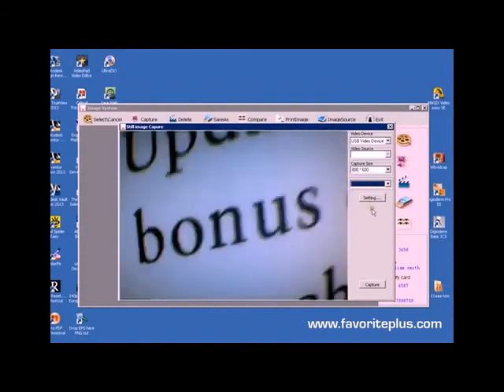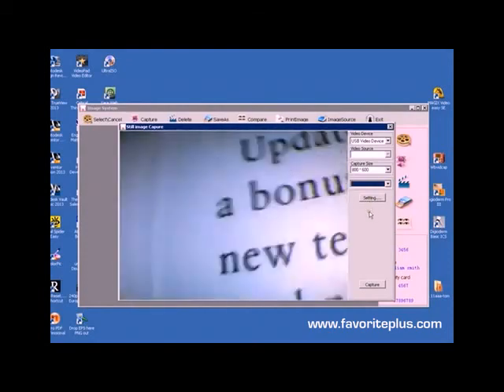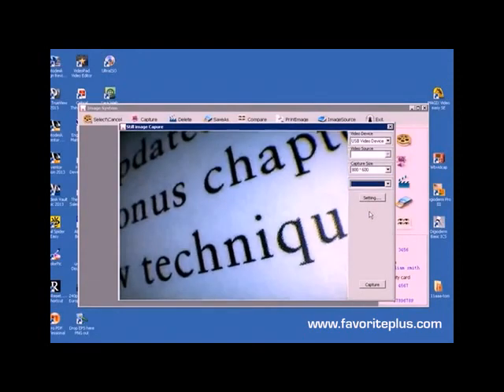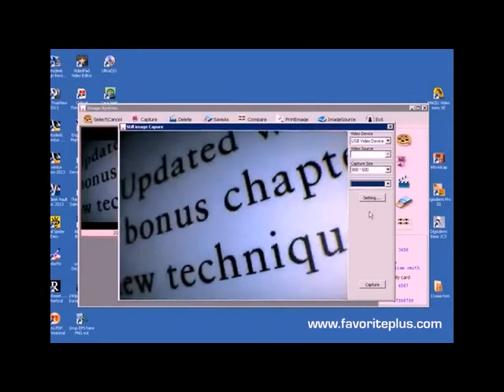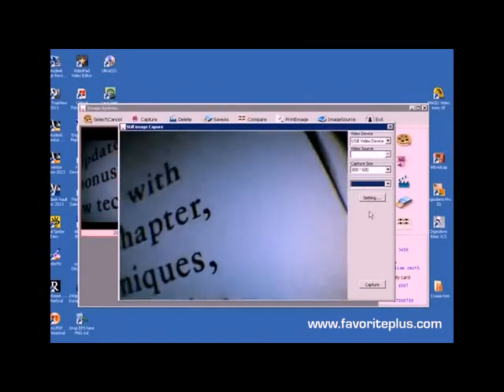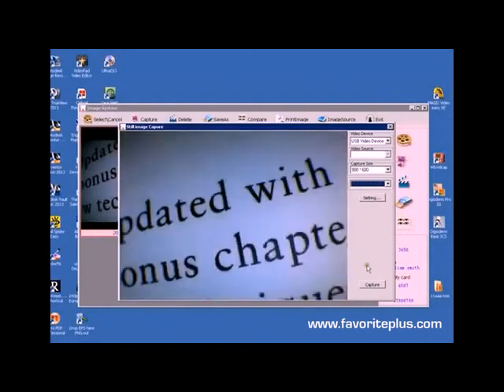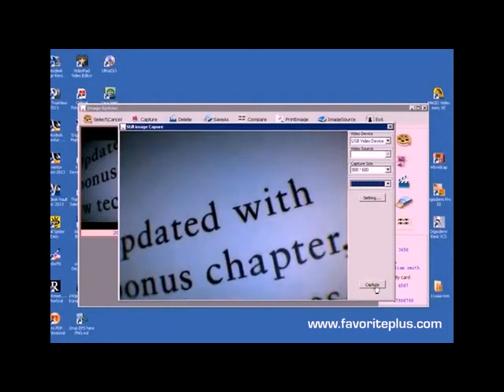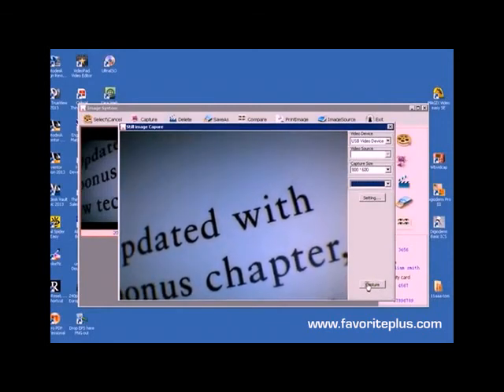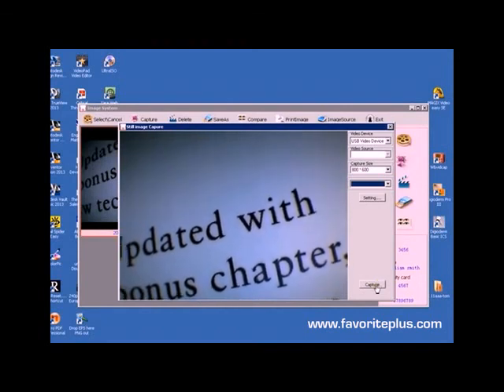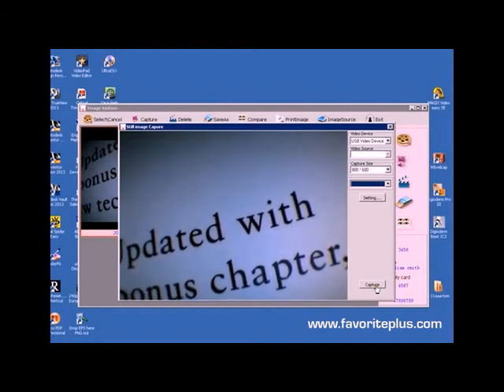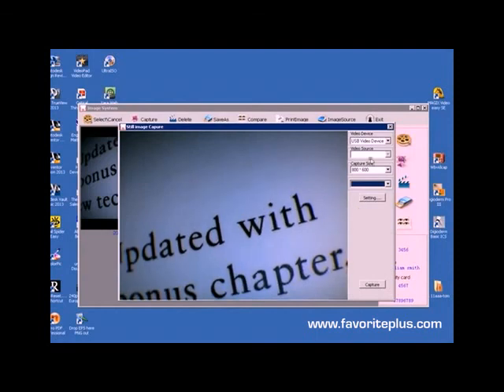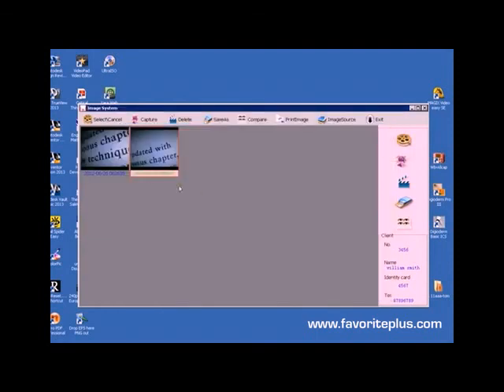Now to actually capture an image, you can either use the actual snapshot button on the camera itself, that's the front button. So if you just click on it, it will instantly capture the image. Some dentists prefer that the assistants click on this capture button here to prevent camera shake. So just click on that and that instantly captures the image.